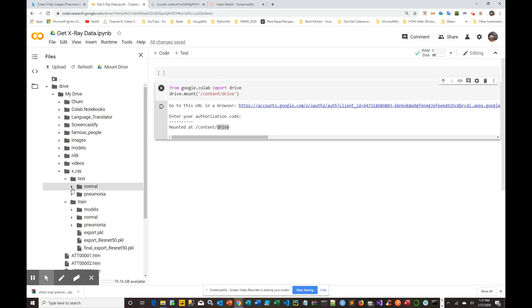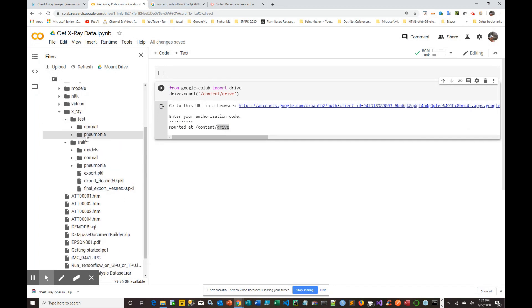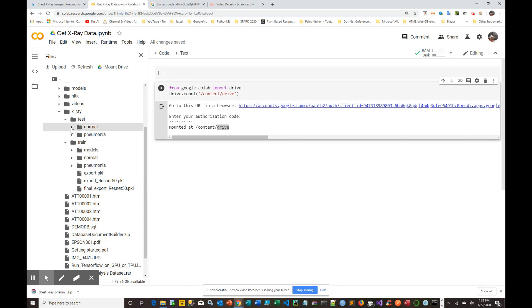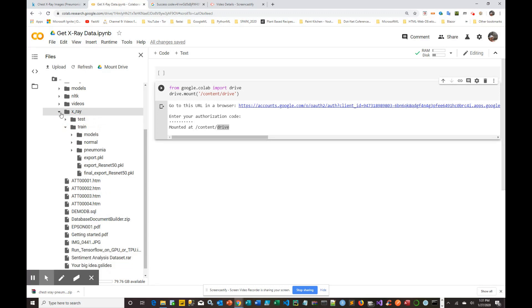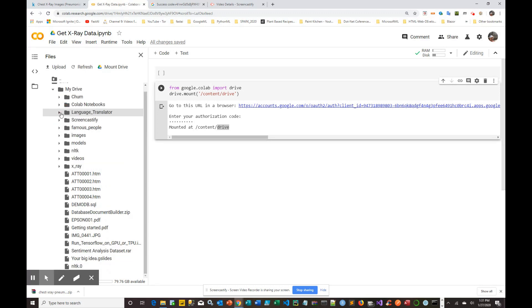Do the same for all the folders: test normal, test pneumonia, train normal, and train pneumonia. Once you're done you'll see all the images populated in each folder. That's how you upload the images to your Google Drive in preparation for Colab.